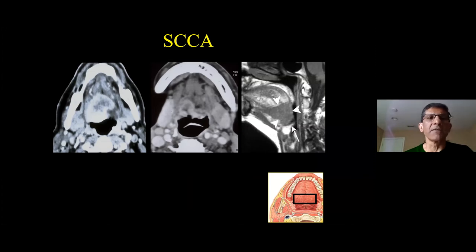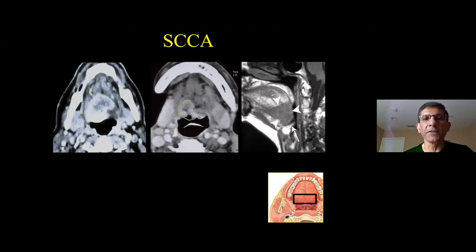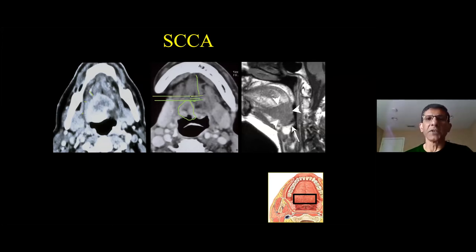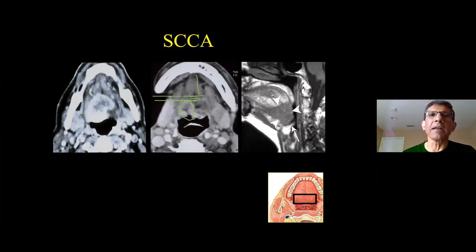These are examples of run-of-the-mill squamous cell carcinoma involving the tongue base. If you see a lesion involving the right lateral aspect of the tongue base, this is how I would contour it. The genioglossus-geniohyoid complex comes into the tongue base, which typically contains a fair amount of fat. By far and away, if you're looking at an abnormality involving the tongue base that is a tumor, it's going to be squamous cell carcinoma.